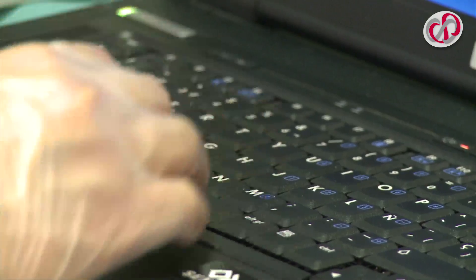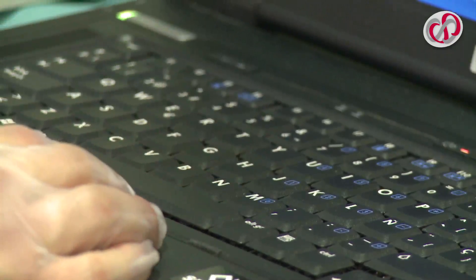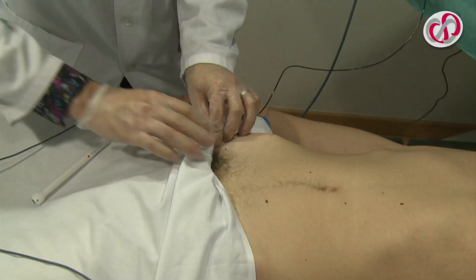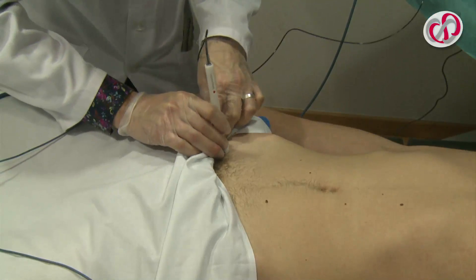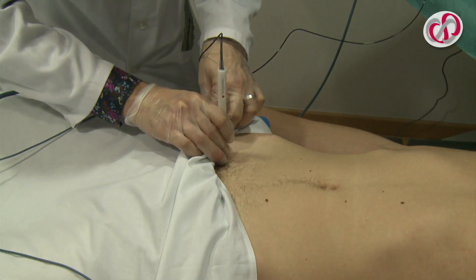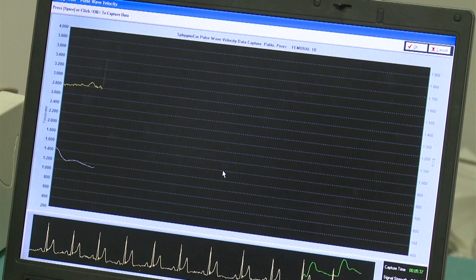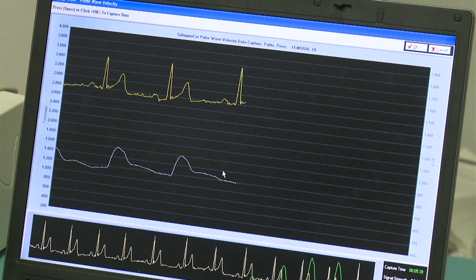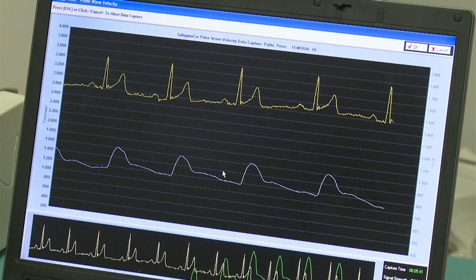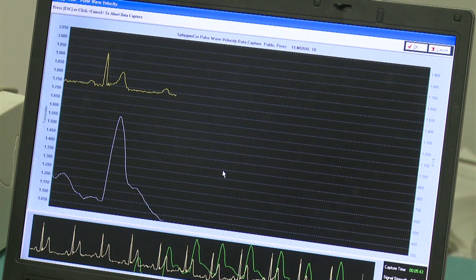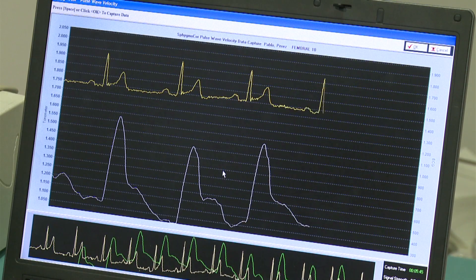To continue, we press the space button and ascertain that we are in the femoral area. Once confirmed, we apply the tonometer over the femoral artery. Once again, a strong, stable and reproducible wave must be obtained that we can register for some 10 to 30 seconds.